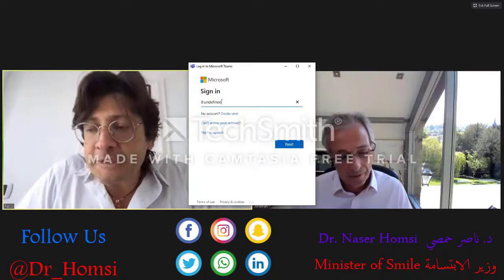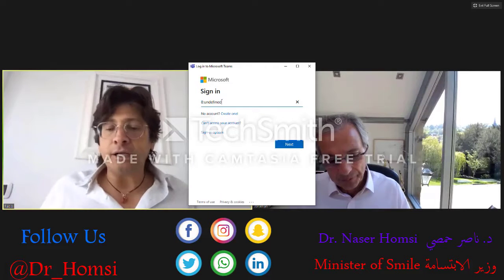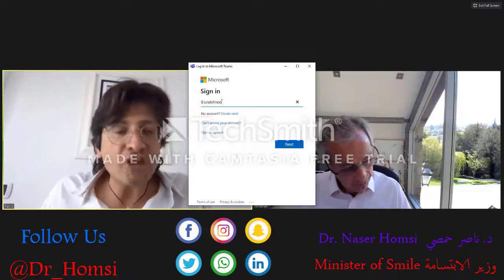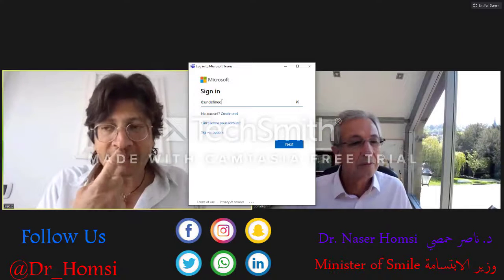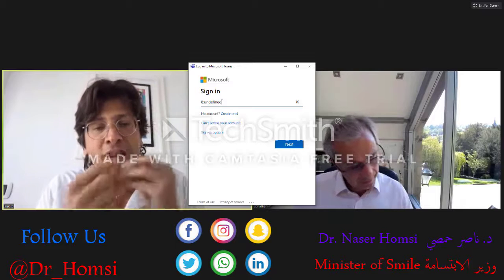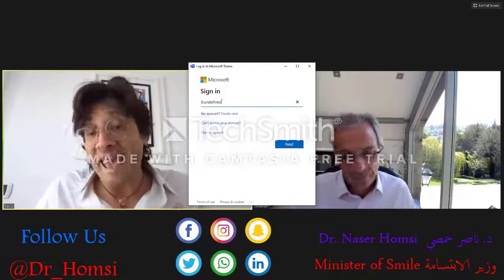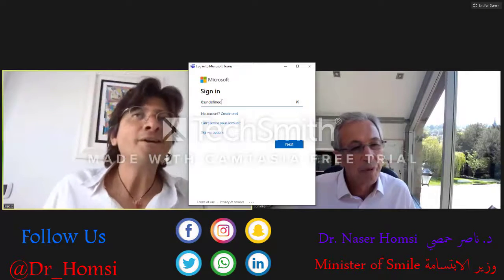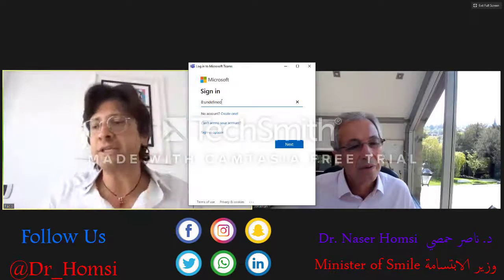Yeah, I have some experience that I've done in the last 3-4 years. And to be honest, it's very efficient to manage this with TADs. I don't like a central TAD because almost never is the patient able to manage the soft tissue. The soft tissue reactions, there are a lot in my hands, also because my patients sometimes don't follow all the prescription of chlorhexidine with the gel.